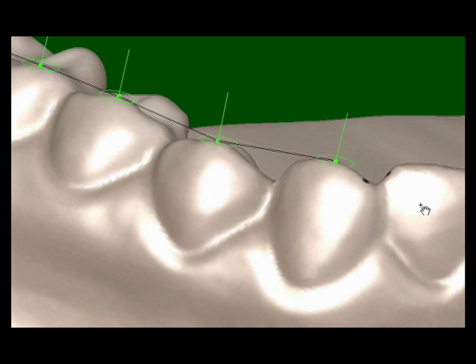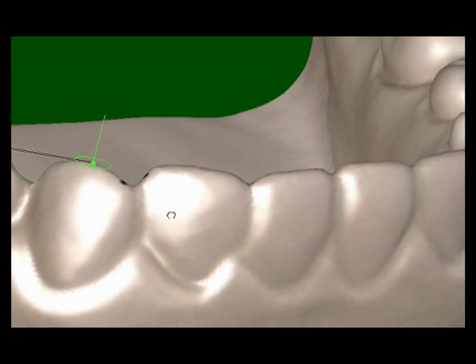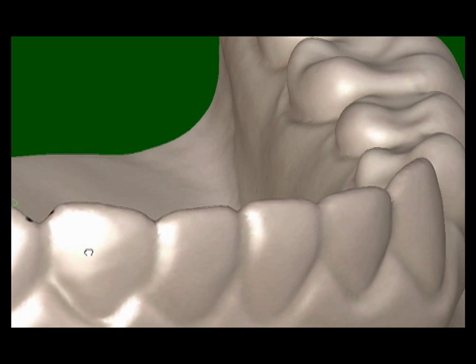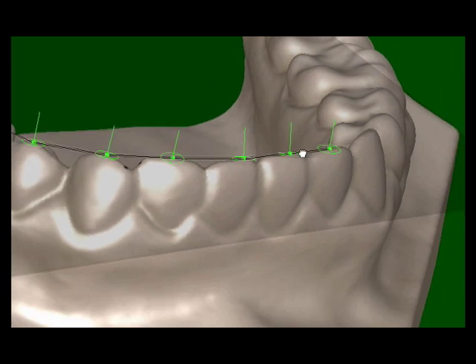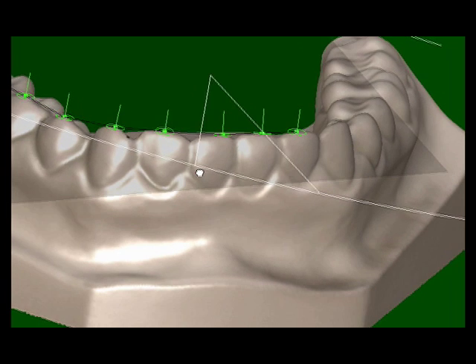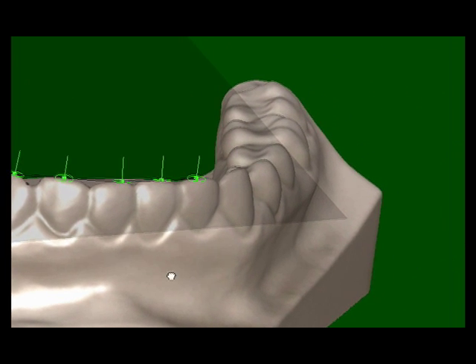An island area is defined at the contact point. A smooth plane is passed through the islands to form a contact surface. A portion of this plane becomes the splint surface.